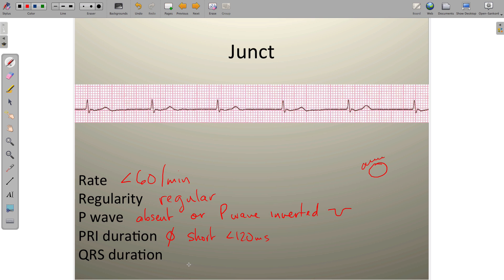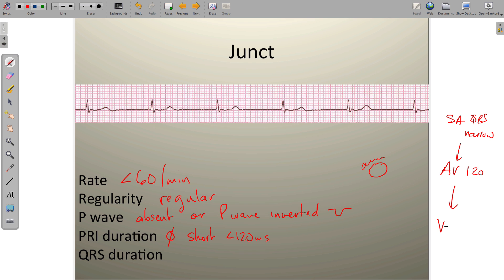The QRS duration kind of does the opposite. As you move down into the heart — starting at the SA node, QRS is narrow; at the AV level it's not wide but on the wider end of normal, around the 120 millisecond mark. As you move deeper into ventricular tissue, you exceed 120 milliseconds. So for junctional rhythm, QRS is around 100 to 120 milliseconds.